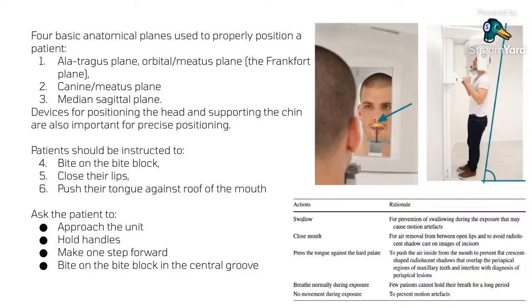But there may be cases when the patient is too tall and your machine is not as tall. You will make the patient sit without a backrest. Make sure it's without a backrest. You don't want the backrest in the image. You will have to make sure that the patient is seated upright, because we want the spinal cord to be as straight as possible.